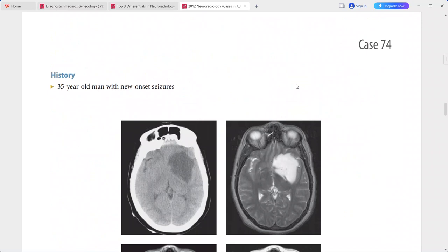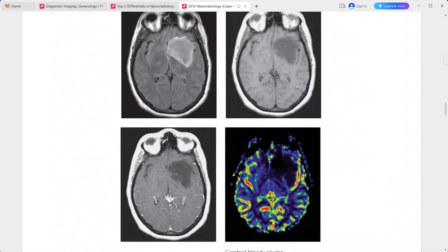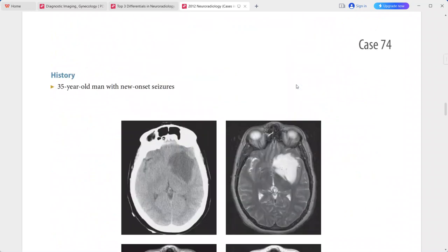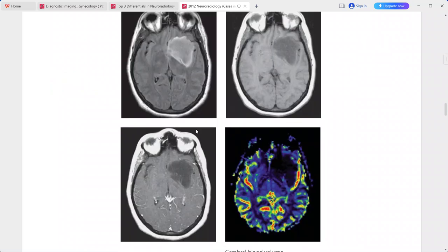Next is a 35-year-old man presenting with new onset seizures. On non-contrast CT scan, there is a hypoattenuating mass involving the left frontal and sub-insular white matter and the left basal ganglia, with mild local mass effect.